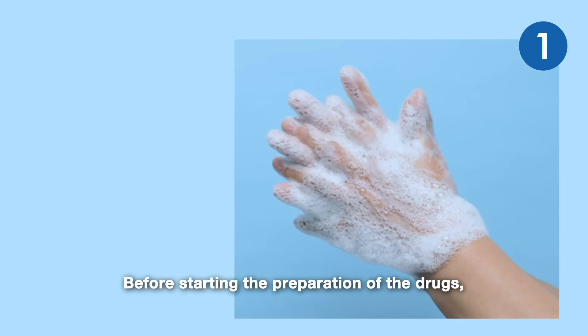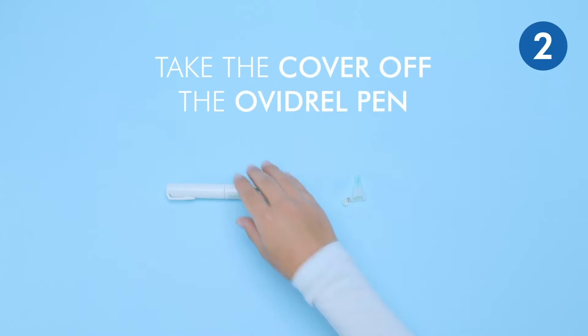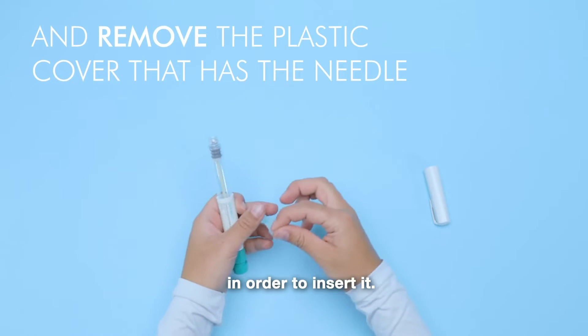Before starting the preparation of the drug, wash your hands with soap and water. Take the cover off the Ovidrel pen and remove the plastic cover that has the needle in order to insert it.